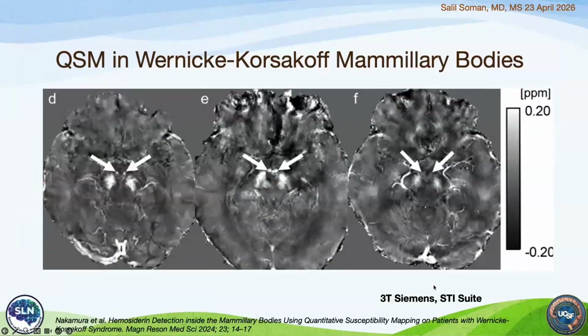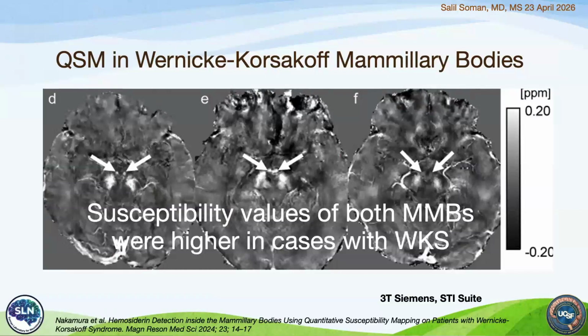For Wernicke-Korsakoff, this was a case series, but what they found was that the susceptibility values in the mammillary bodies were higher in Wernicke-Korsakoff syndrome compared to the people who didn't have it.